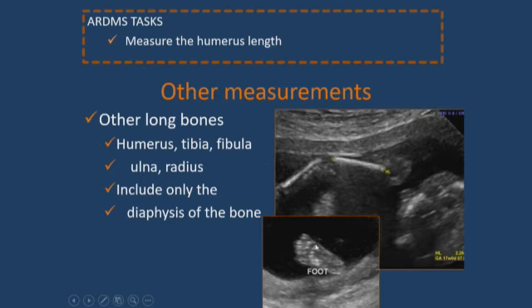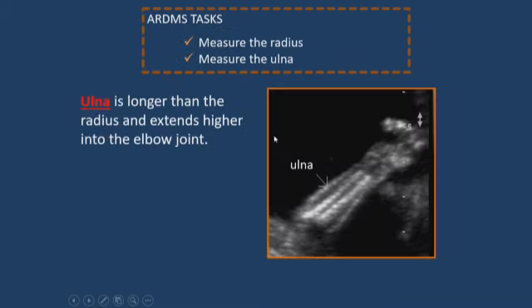We do also include looking at the foot if there's an issue, because the femur and the foot, when we're looking at that, the femur-foot ratio should almost be 1 at this time. The foot grows at about the same rate as the femur length all the way up until about 28, 29 weeks. Other things that you can look at is the clavicle. But again, these are only for very specific abnormalities or if you're suspecting a problem.